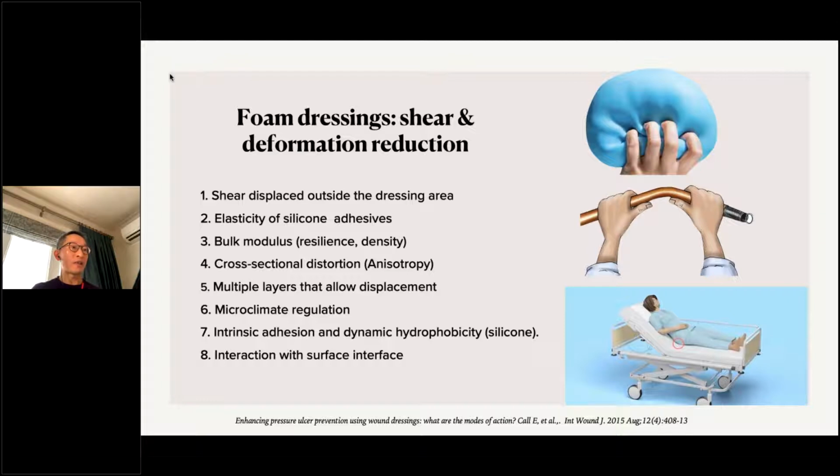So, and then you have the multi-layer, and that's the whole catch about why a multi-layer system or multi-layer dressing is better than a solid single layer. Because so far we don't really have any good evidence that a solid single layer foam dressing is equivalent to the performance of a multi-layer foam dressing. Not yet anyway. So the theory is that with multi-layer foam dressing, it can slide against each other to provide that shear reduction mechanism. And it also depends on the backing of the dressing material.